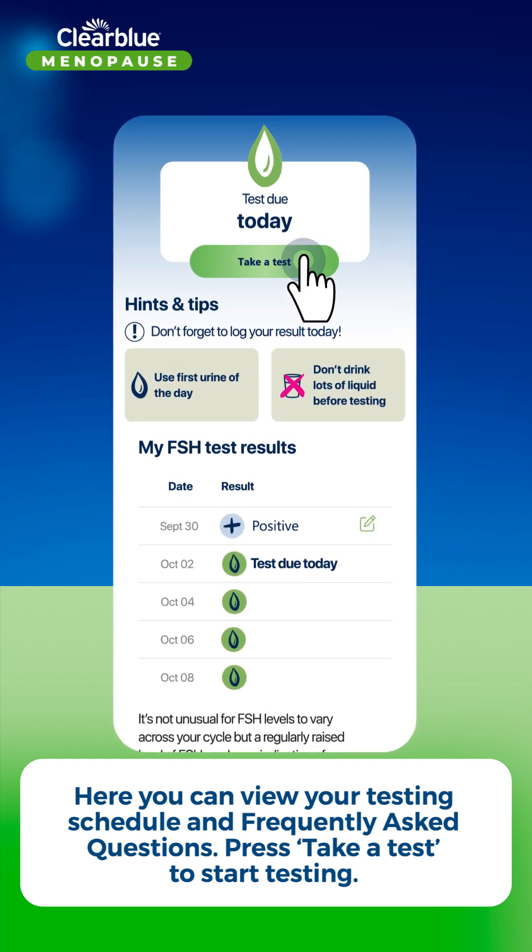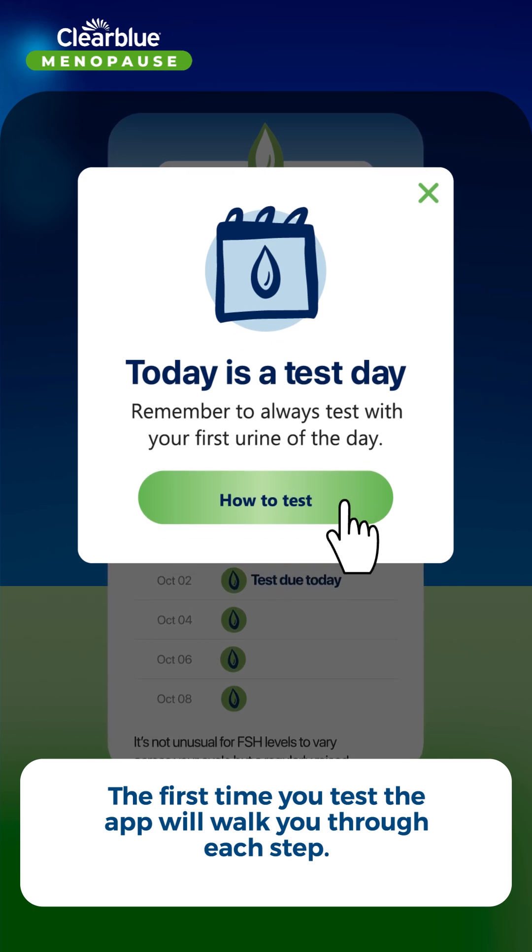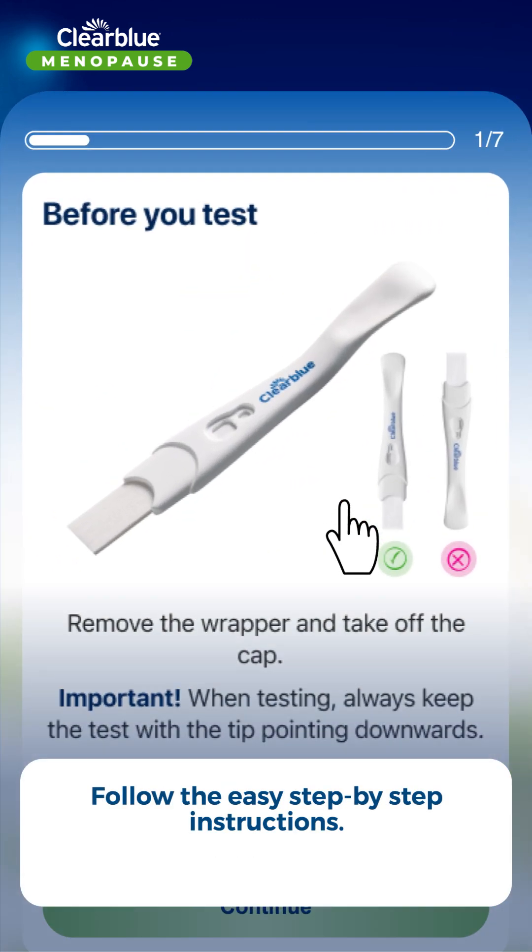Press 'Take a Test' to start testing. The first time you test, the app will walk you through each step. Follow the easy step-by-step instructions.